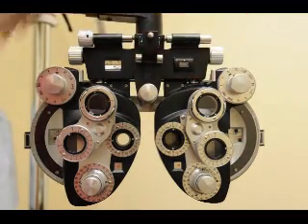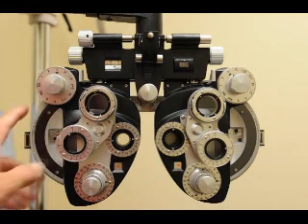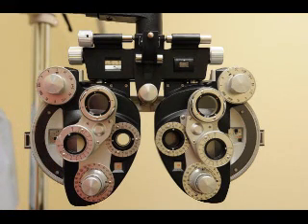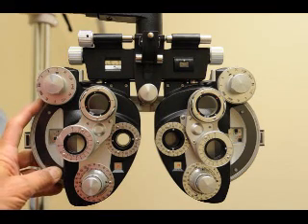Close the left eye and refract the right eye. Put up the 20-40 line. Assuming no reason to think the patient is abnormal, you refract off the 20-40 line. Say 'Read those letters as best you can.' They say 'E4.' Good.